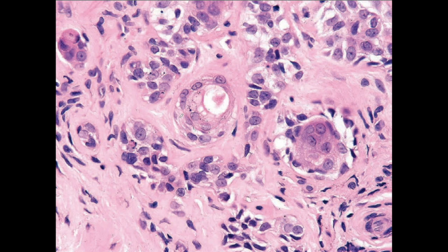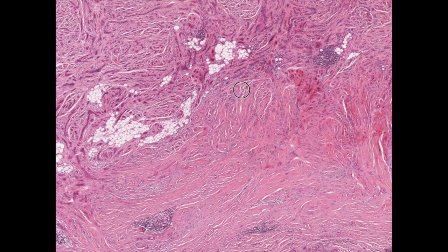Immunostains like EMA or CEA can help to highlight tubular differentiation. If you look carefully, we also can see the myoepithelial cells. So for MAC, myoepithelial cells are preserved. In the opposite, in breast carcinoma and apocrine carcinoma, we don't see the myoepithelial cells. At the base of the lesion, it usually shows infiltrative islands of basaloid cells. It looks similar to morpheaform BCC here.